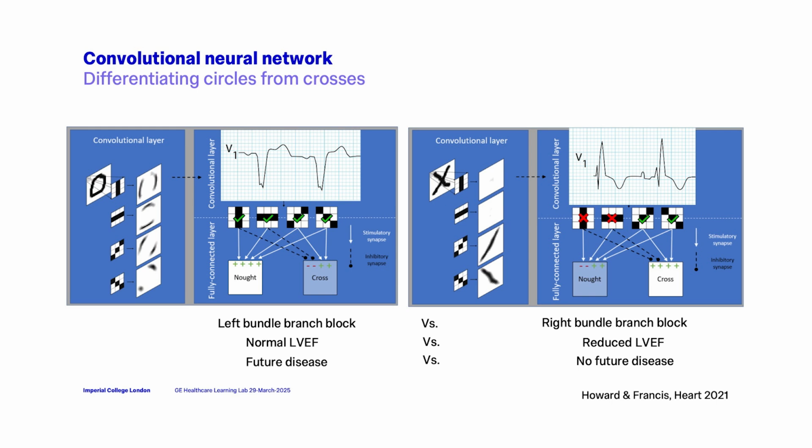What you need to do merely is to provide the model with a lot of circles and tell the model these are circles, and give the model a lot of crosses and say these are crosses. And that's really all the human needs to do. You can tweak all kinds of hyperparameters to try and make the model more efficient or let it learn more about the task. But really, these things are set up in such a way that you just need to give it labeled data. So give it a lot of crosses and a lot of circles, without telling it any rules.